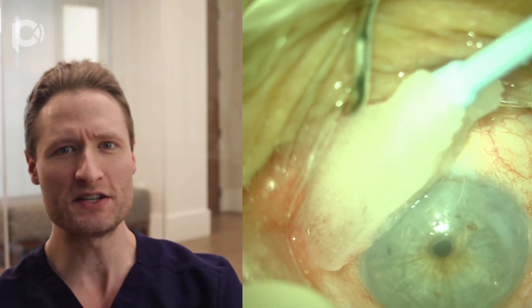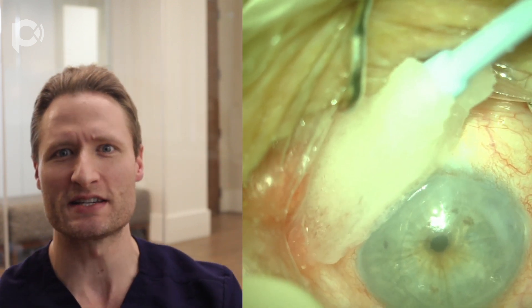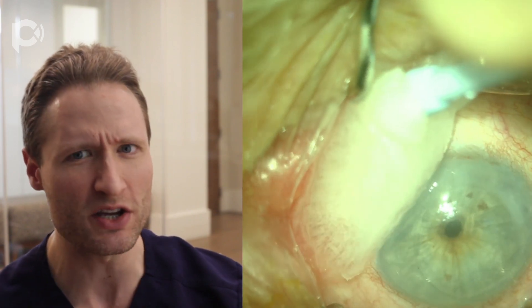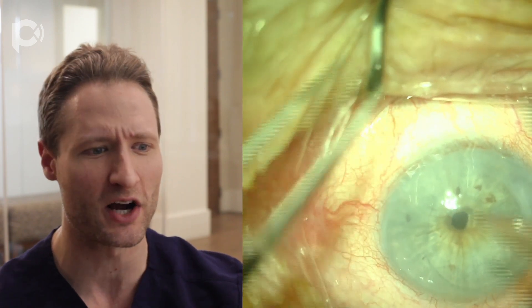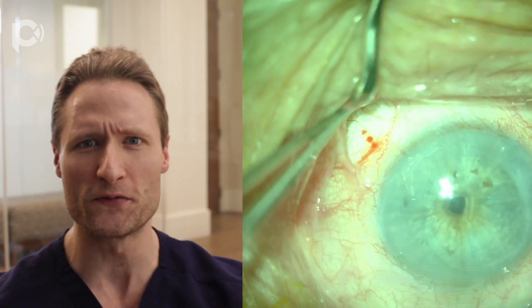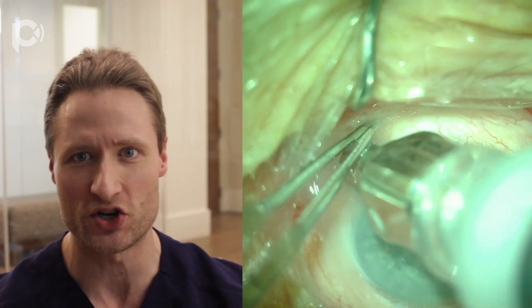I want to share with you a technique for DMEK graft unfolding that is extremely useful in a variety of different circumstances. This technique was not invented by me, but rather by a Japanese ophthalmologist named Takahiko Hayashi. He is a brilliant corneal specialist who has a YouTube channel describing a number of impressive surgical techniques, including this one: the double bubble technique. It is useful for graft unfolding in situations of hyper deep anterior chamber.